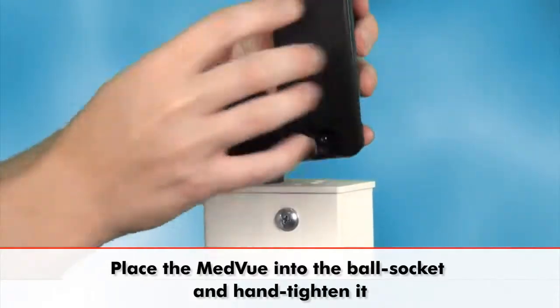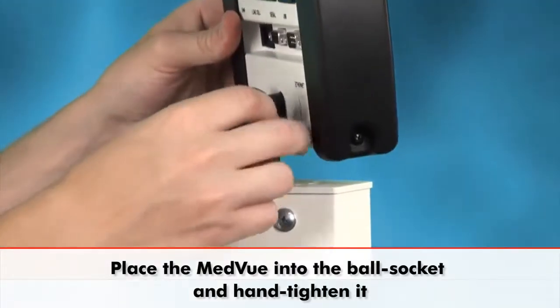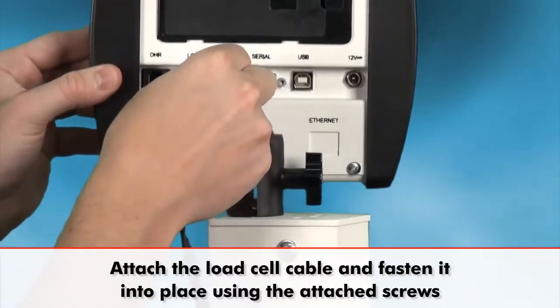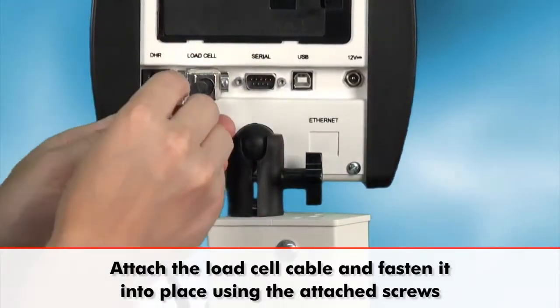Place the MedVue indicator into the ball socket, tighten it hand tight and then attach the load cell cable and screw it into place using the attached screws.